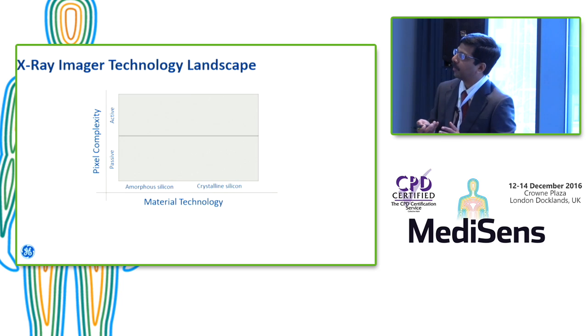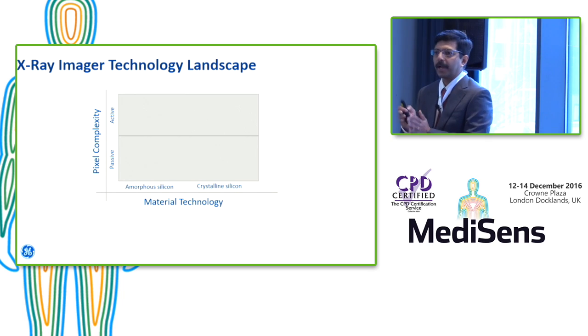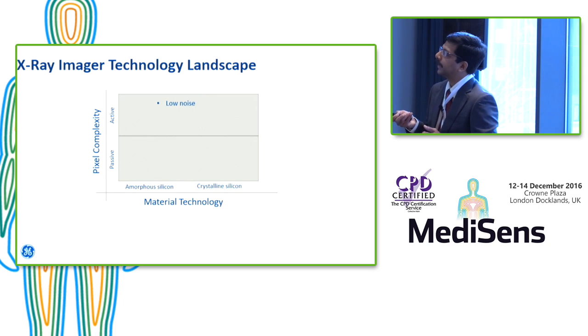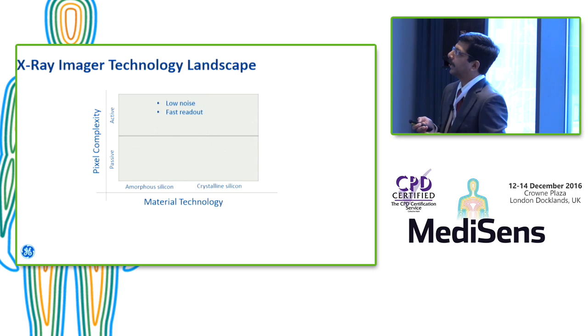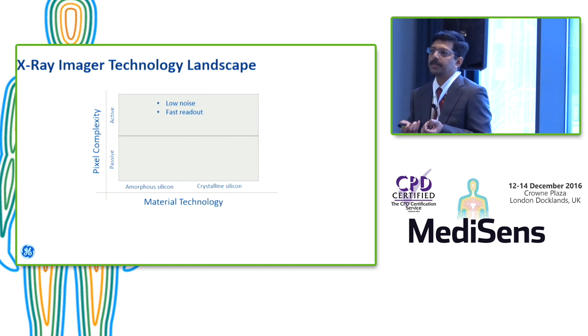Now, if you look from the pixel complexity, again, the traditional flat panels are passive pixels, with one photodiode and a transistor, just a switch. But an active pixel, which has an amplifier inside the pixel, essentially helps to drive the noise down significantly. I think you'd be surprised. Even putting in a simple transistor, like a 3T architecture, these classic APS, will cut the noise by a factor of 10. To give an idea, in a TFT panel, the noise is about 1600, or in the range of 1500 electrons, in a typical flat panel. It's very easy to make a 150 or 100 electron noise CMOS active pixel with this 3 transistor, the simplest of pixel designs.